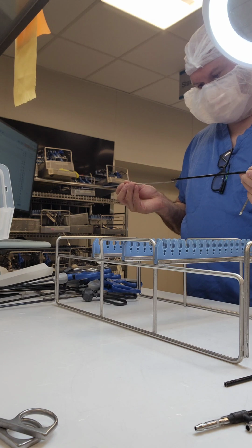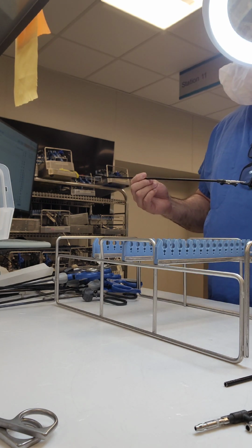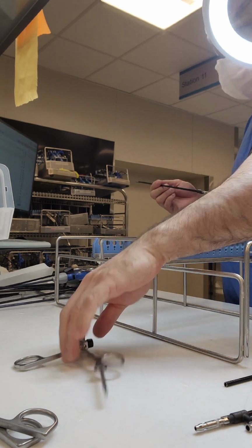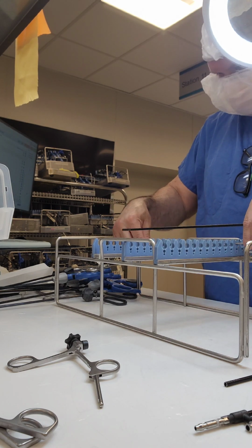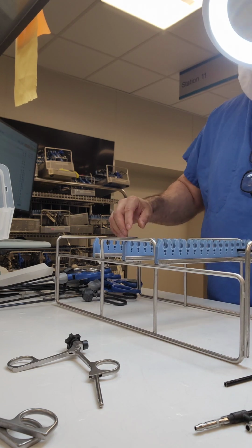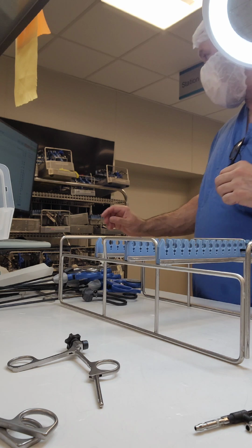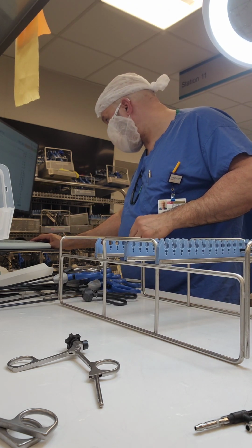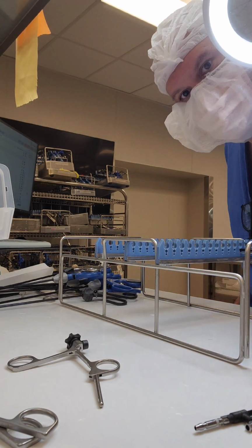You have to make sure that these lap instruments fit in the sleeve, that you can turn it and lock it, and that when you attach that handle on it, it's going to do what it's supposed to do. Then I organize it on the rack nice and neat, making sure everything is in its place, trying to follow the count sheet as best as possible. That way identification in the OR is quicker and more efficient.